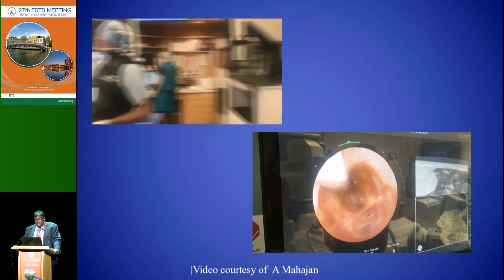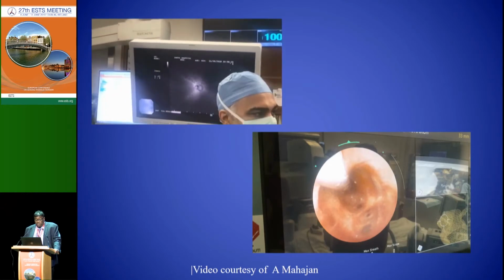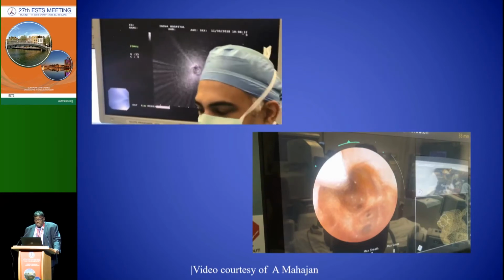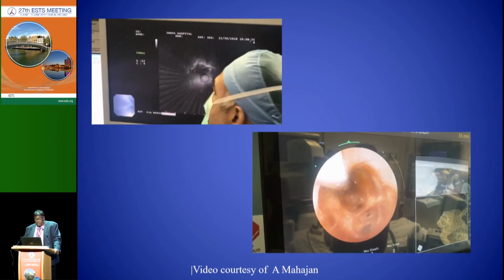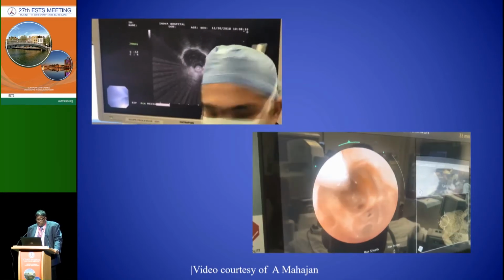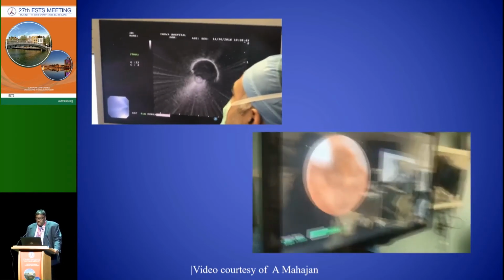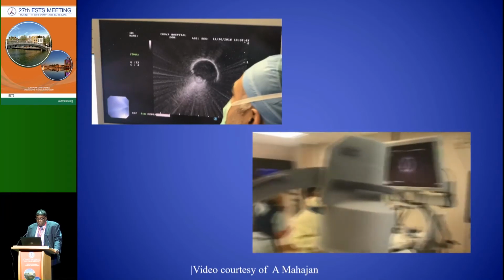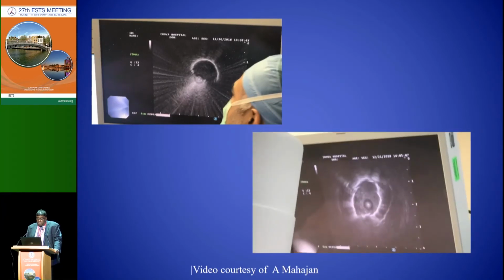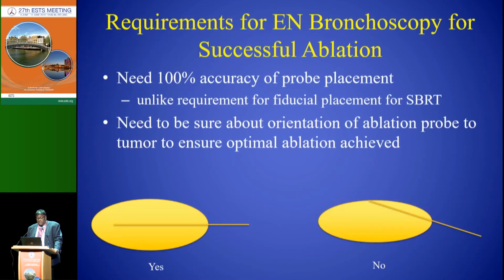And here you can see on the video, using fluoroscopy, they've already navigated down to the lesion, and now he's going to put in the radial EBUS probe just to show that he's actually in the lesion. And you'll see the radial image coming in, and you'll see the tumor over there. And then if you look on the second video, this is at the subsegmental level. So you're going down much further than you can with a standard bronchoscope. And you can see things that you could never see with a normal bronchoscope. And there you see the tumor and the probe right in there, showing how you can biopsy these things.